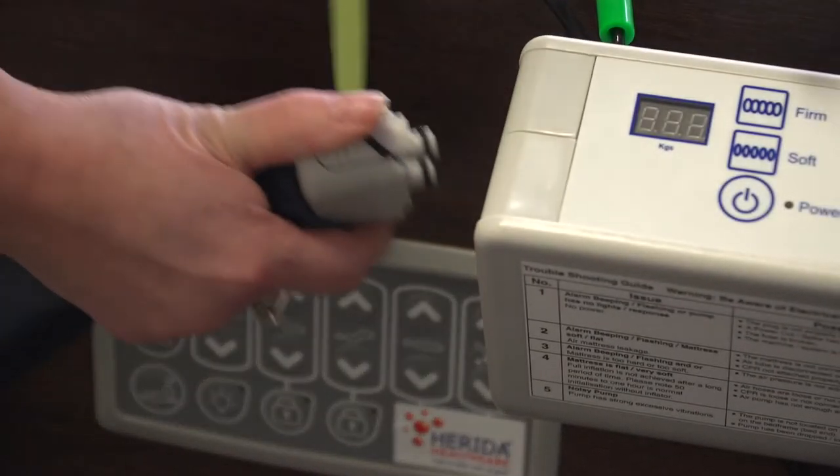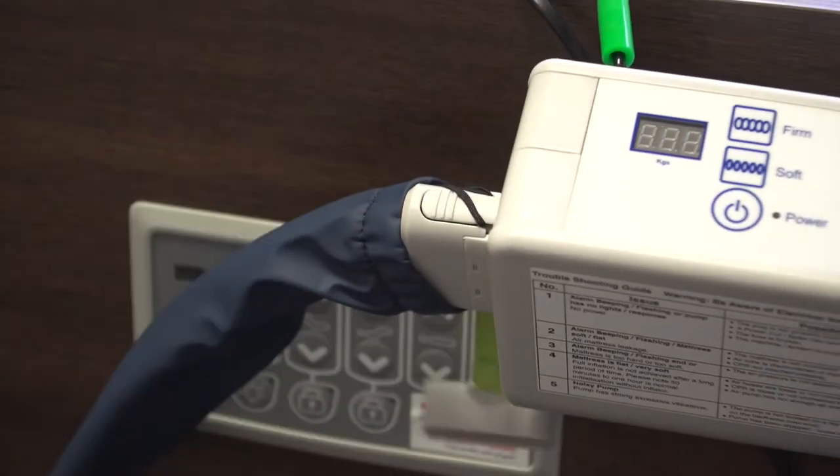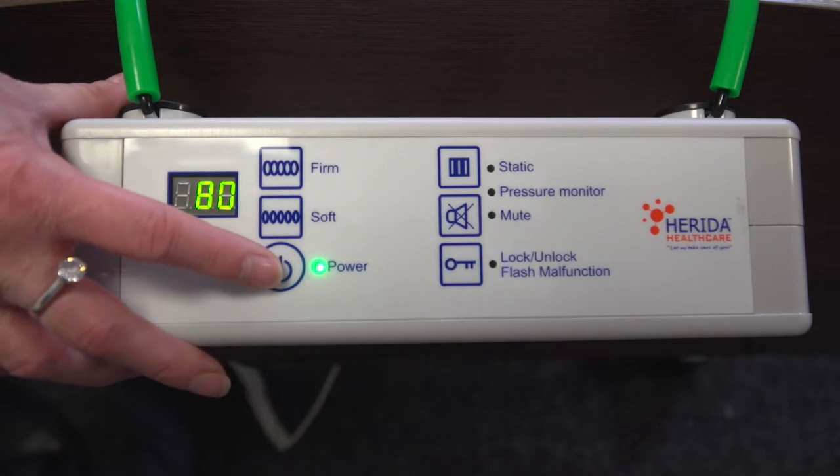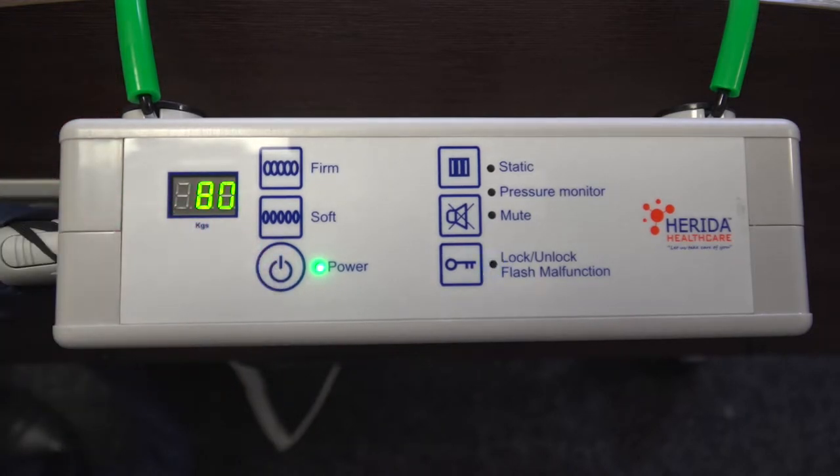The Herida Moray Combo operates with a digital pump. Switch the pump on at the power socket and press the power button on the control panel. The pump will automatically inflate to 80kg, which offers 22mm of mercury in pressure into the cells. To set the pump to operate with the patient's weight, we need to first unlock the pump.